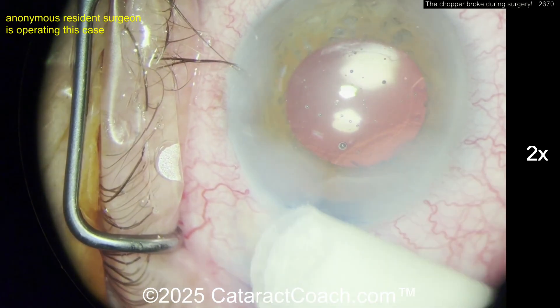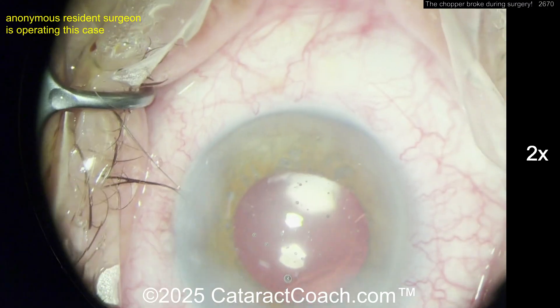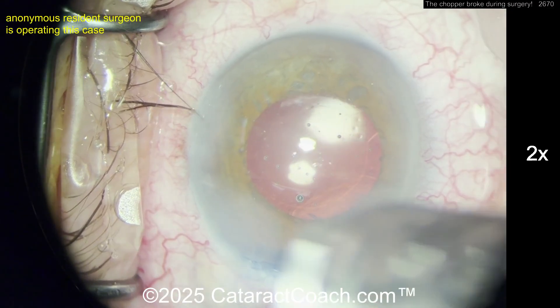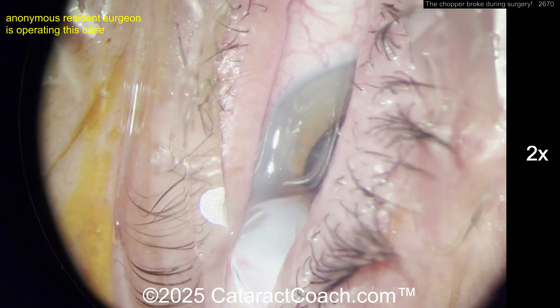If there was a little bit of iris damage, I probably would not do anything to it — I wouldn't suture it up, it's too small. Interesting case. If you're a resident, send in your cases — go to cataractcoach.com and use the link to submit. Please upload interesting cases like this that feature complications, because complications are our best way of learning.